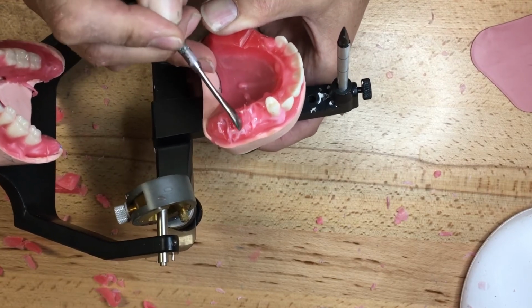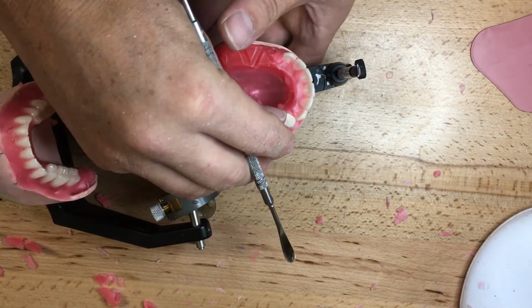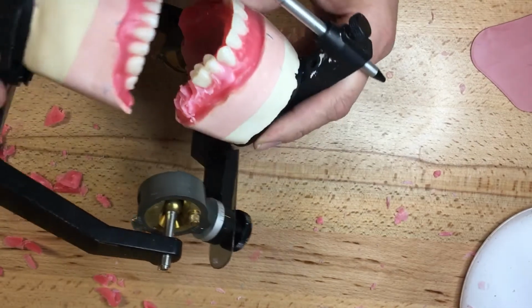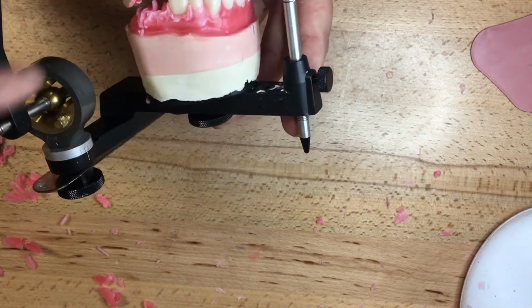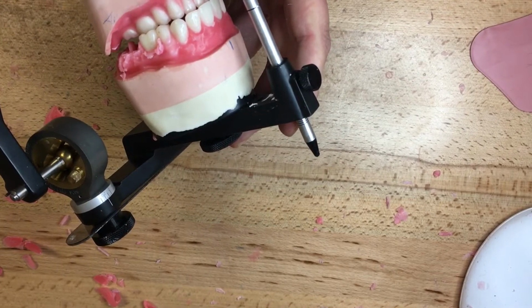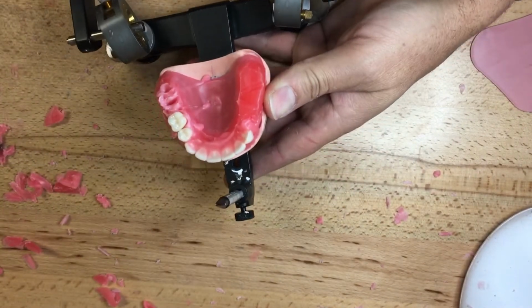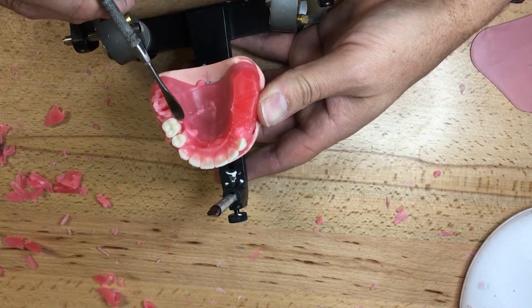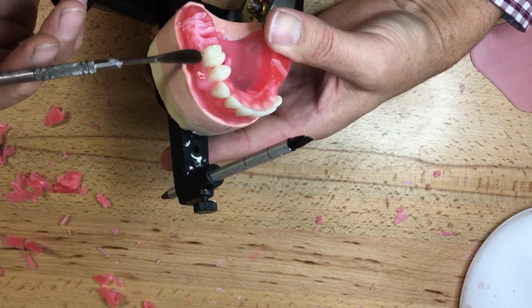So I'm going to soften up the posterior segment here. Let's reintroduce number 6. Try not to get any wax on the occlusion. And as you can see here in this position, is a perfect tooth-to-tooth relationship, 6 on top of 6, with a slight amount of overjet still in the posterior segment. And then I'll move on to number 7. Keep in mind, I'm thinking of waxing up all the time. So I might as well start now.